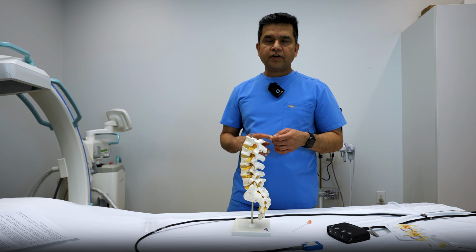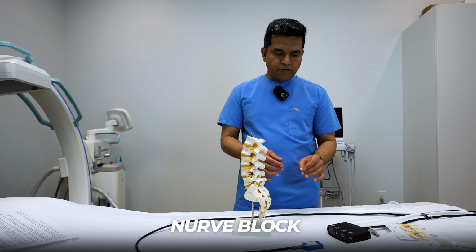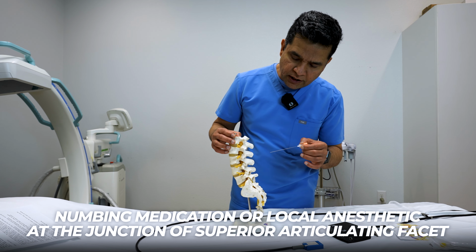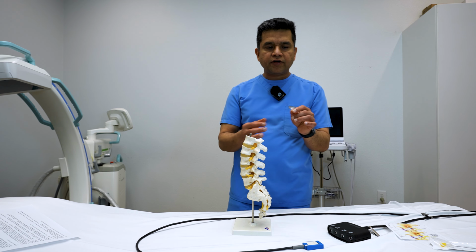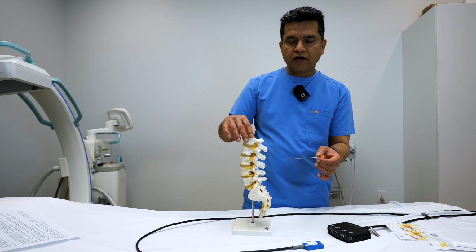So this is essentially a 3-step procedure. The first 2 steps are only a nerve block, where we use tiny needle to place small amount of numbing medication or local anesthetic at the junction of superior articulating facet and transverse process. That's this junction here. And you can see it's a very tiny needle. It only needs to go in about 2.5–3 inches deep. We are not even entering the spinal canal. It's a pretty safe procedure.